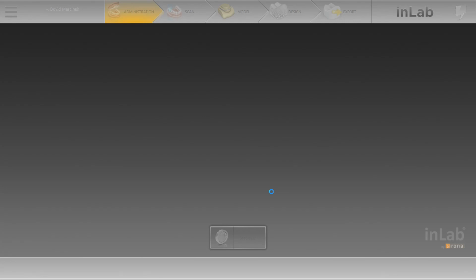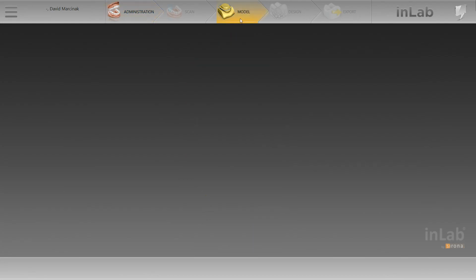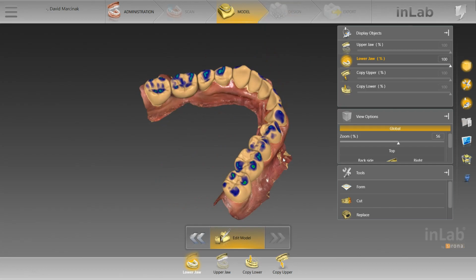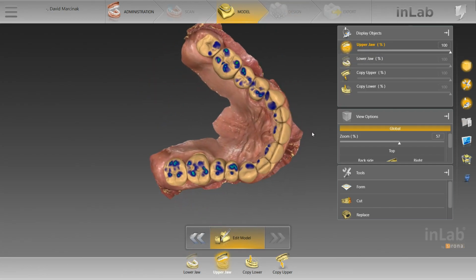Also, you have to label the teeth as crowns when you're doing a wax up. It would be more convenient if you could label it as a bridge, because then you can adjust the pontic margin really easily, but it won't virtually seat a bridge, so they have to be crowns. But now you can see in the model phase, everything's virtually seated. Looking good. Great occlusion, you know, considering what we started with.